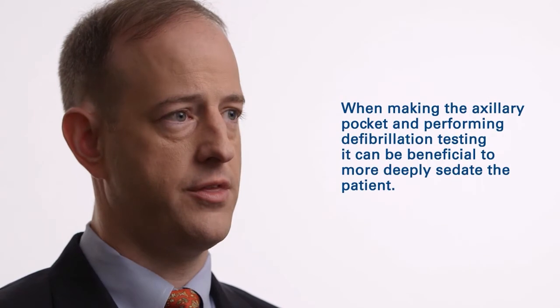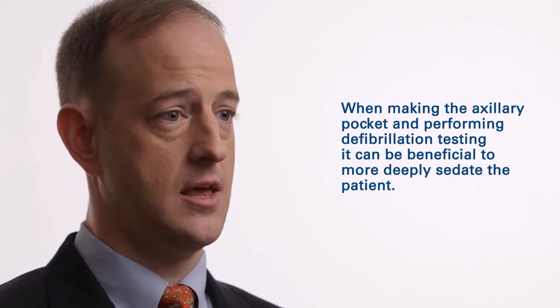By communicating these concerns with the anesthesiologist, the need for total general anesthesia has seemed superfluous, and a moderate or MAC anesthesia appropriate, with the understanding that at times we would need to be deeper than others. I have, in the course of the last 5 years, had an opportunity to see many different physicians implant subcutaneous ICDs, and to discuss with many implanters their individual practices.